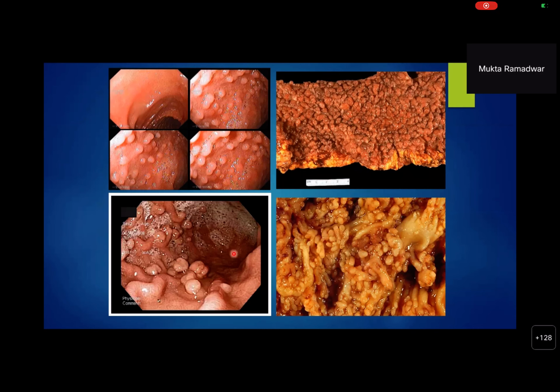Yes, ma'am. I'll take a minute to speak on optical diagnosis of polyps. Yes, please. We know little of it. It would be interesting. So the conventional endoscopy images that we are seeing are white light endoscopy. Now you have high definition white light endoscopy, and most of the scopes today have optical imaging features, called virtual chromoendoscopy, such as narrowband imaging. There are other companies that have other things. This gives about 70 to 140x magnification, and the virtual chromoendoscopy filters some wavelengths so that the surface mucosal and vascular pattern is seen better.